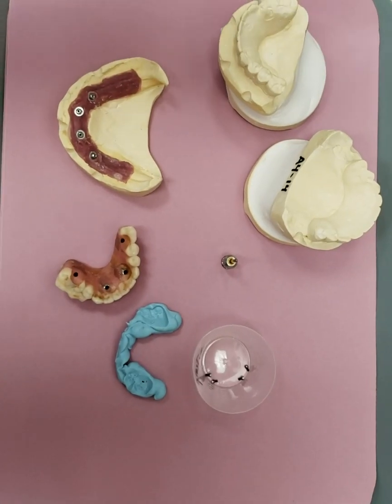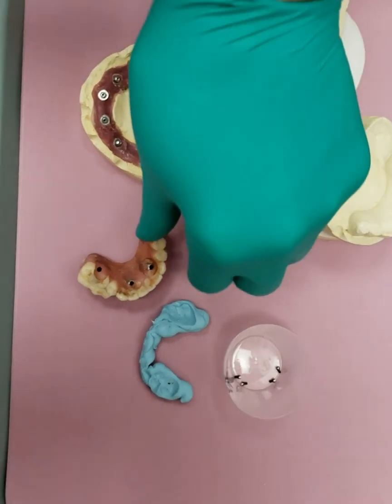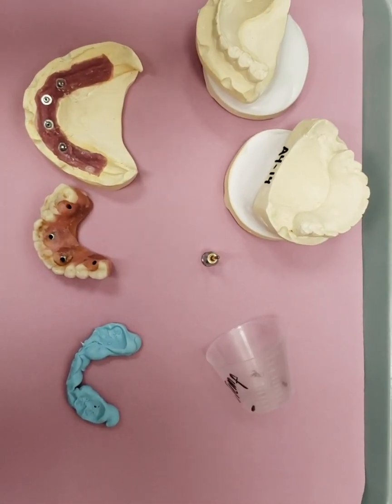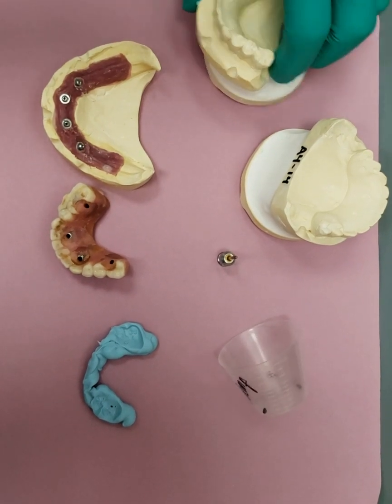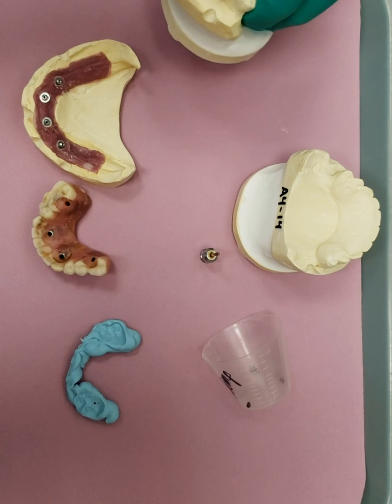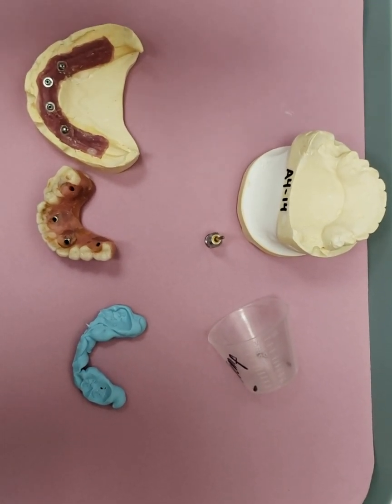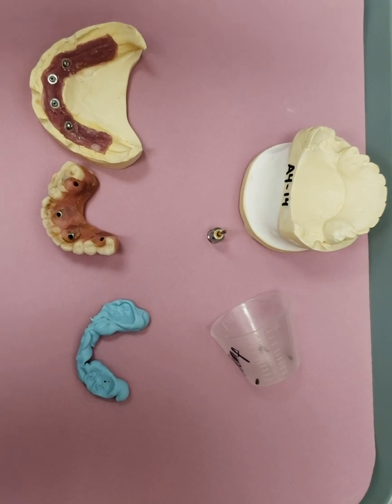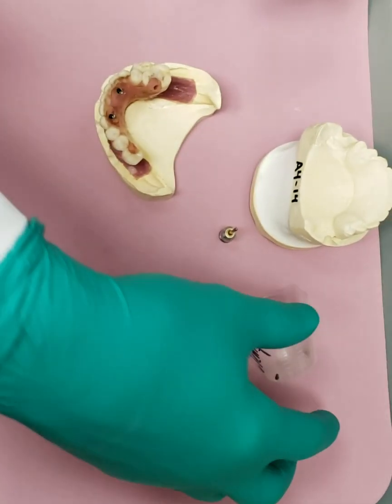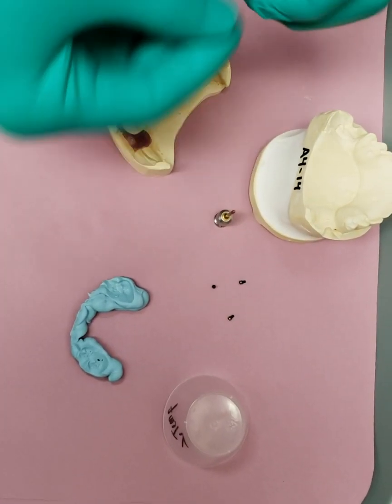The single arch Gordon protocol is you'll have the screws, you'll have the prosthesis, you'll have one of the bites that you took, the screwdriver, you'll have actually both the upper and the lower study model. In this case, we'll just be using the upper study model, and that's how you start. This is how you'd restore a single arch. Then what you do is take the prosthesis, put the prosthesis on, and screw down each of the screws.